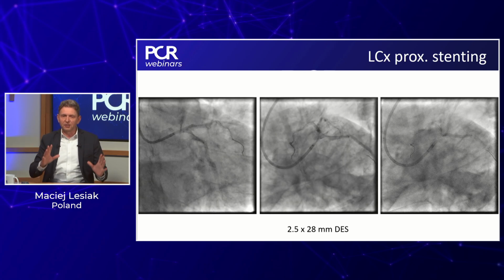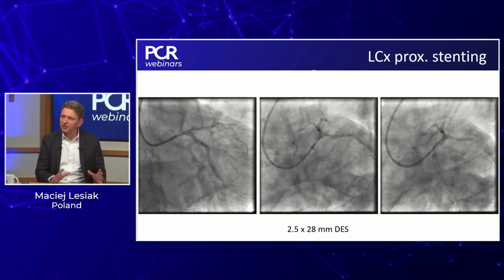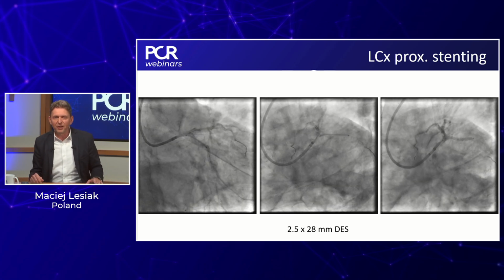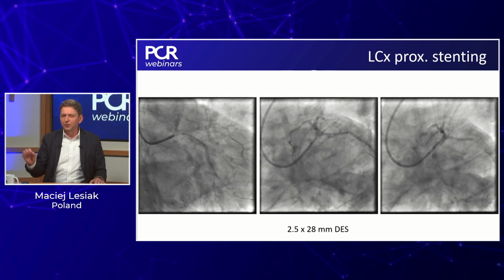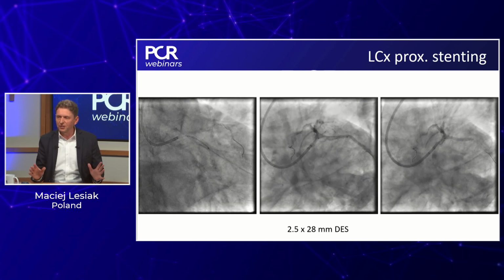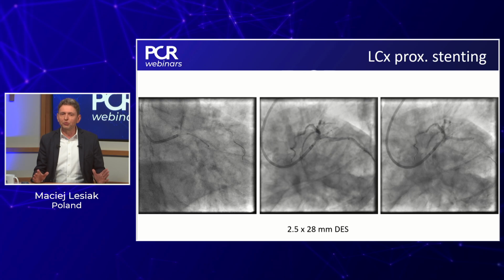2 hours already and a lot of contrast use. The patient was a little bit exhausted. The doctor could be fatigued, of course, the operator. And this is one of the reasons we chose maybe not the optimal bifurcation stenting strategy. So the operator chose just to nail the ostium.